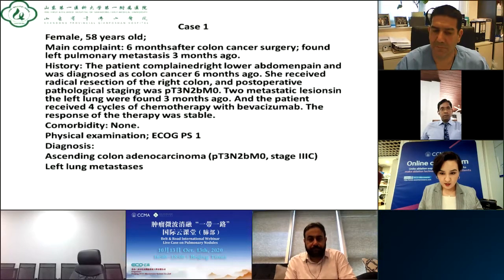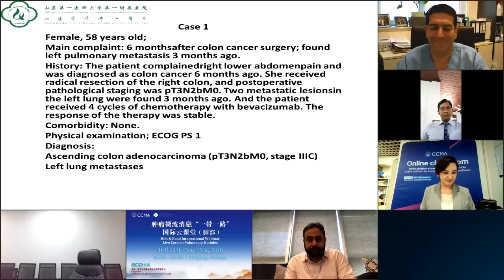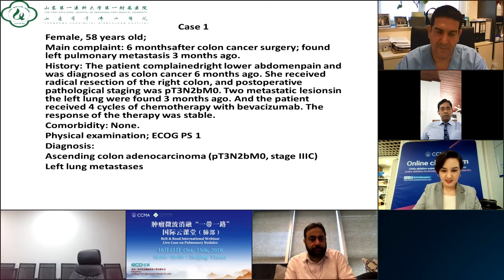So they are prepping for the operation now, and yeah, we're in the operation. Okay, we are ready now. Can you hear me? Yes, I can hear you. Yeah, Dr. Ye is ready. Okay, please start the imaging. We're all set up for you.